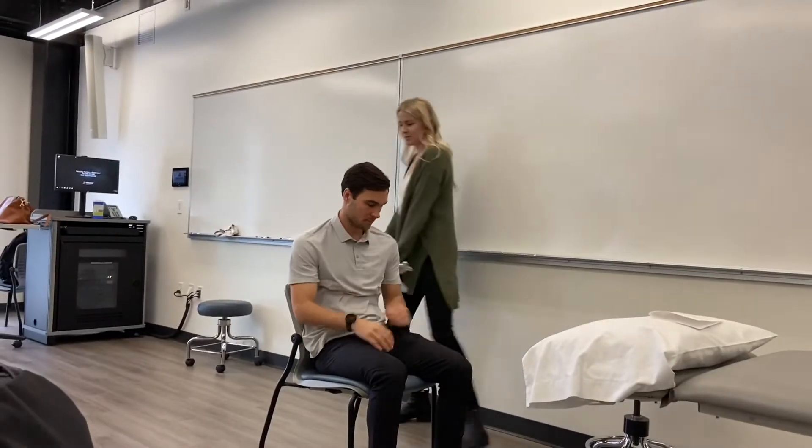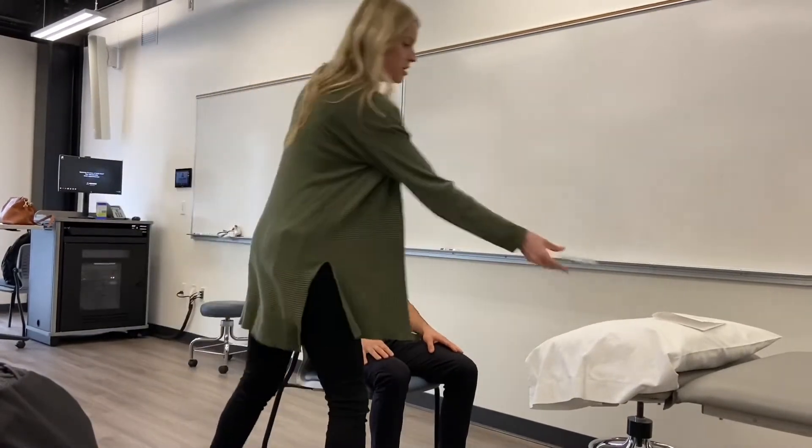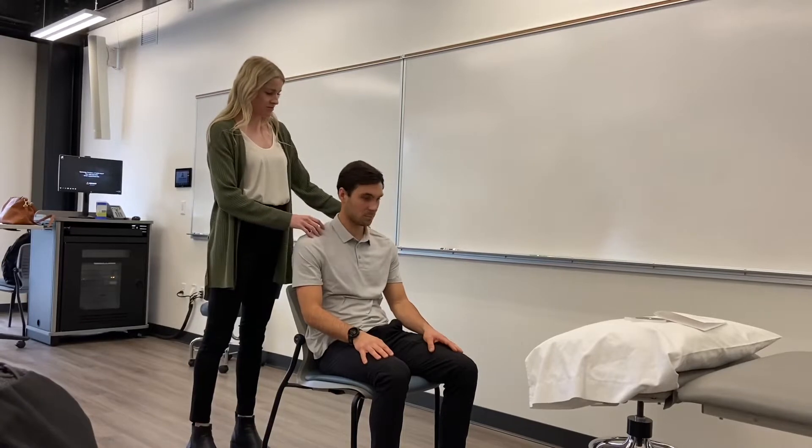Feet should be on the ground, hands can be on their lap. We're going to start with flexion and extension. Your landmarks — he's just going to be in neutral. Your axis of rotation, and we're going to do all active range for cervical spine, which makes things a little bit easier for you guys.